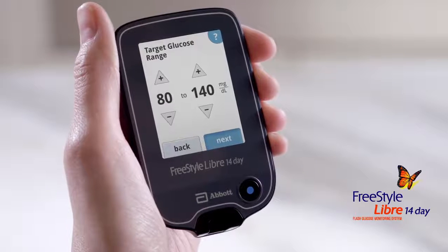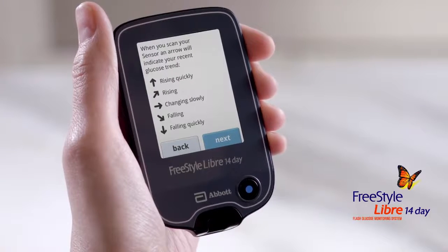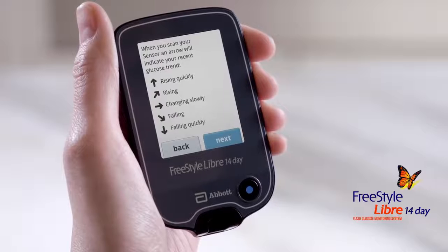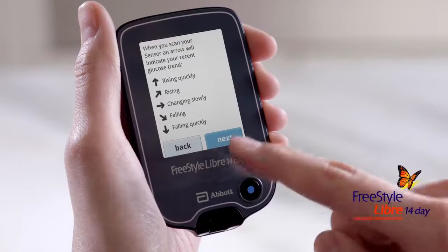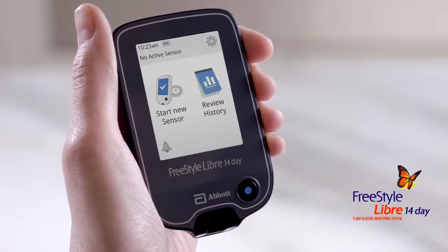Tap Next to continue, and your reader will display how to read the glucose trend arrows. When you tap Next, a series of 4 additional screens will appear with important information about how to use the system. At the last screen, tap Done to continue, and your setup is complete. Now, let's apply the sensor.